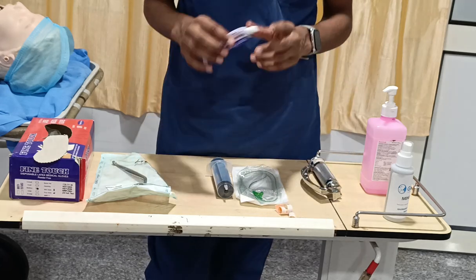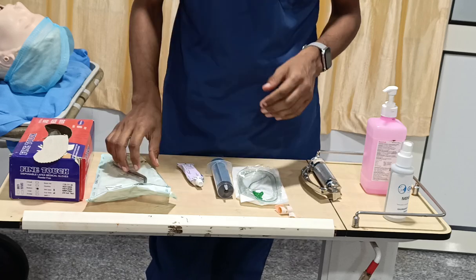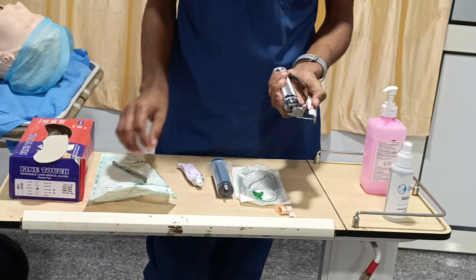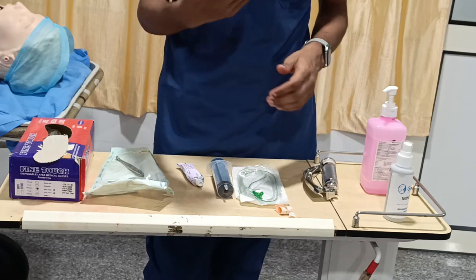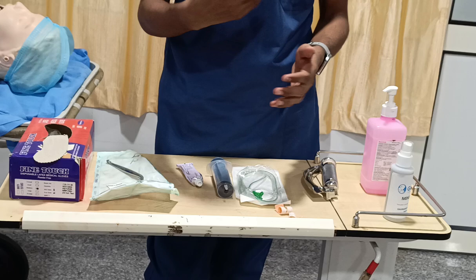And then you have to take the 2% Lox or lignocaine jelly for the lubricant, which at the same time gives local anesthetic action. If the person is endotracheally intubated, you have to take your laryngoscope and then Magill's forceps, because the tube will coil in your mouth, in the oral cavity itself. To prevent that, we will do a gentle laryngoscopy, and with the help of Magill forceps, we will guide the Ryles tube into the esophagus.